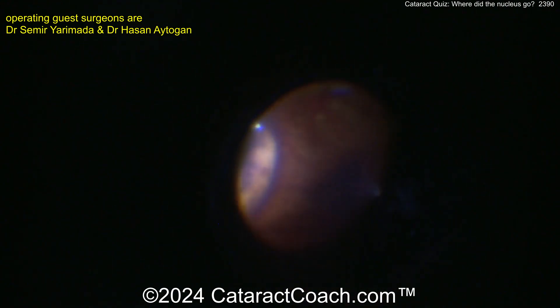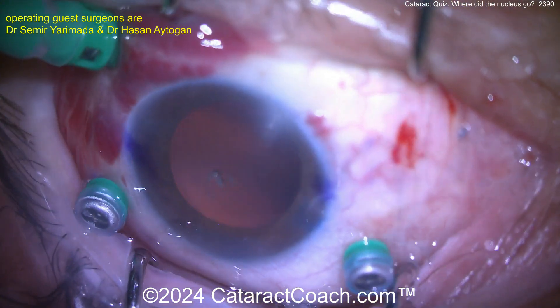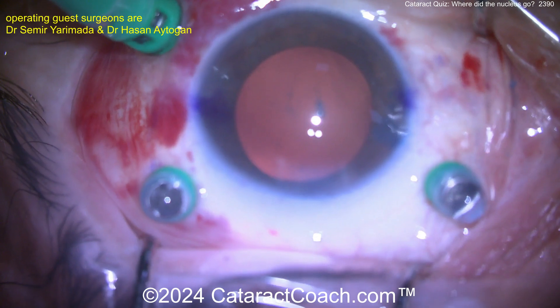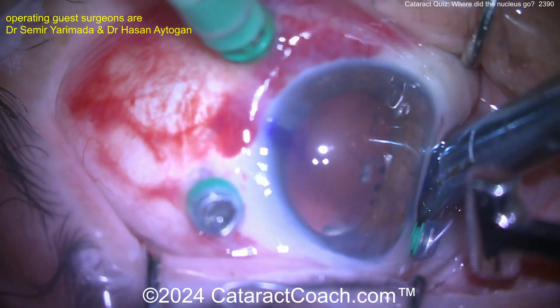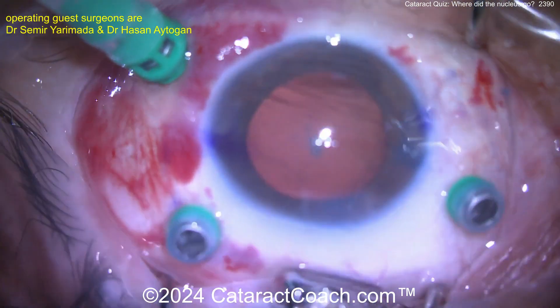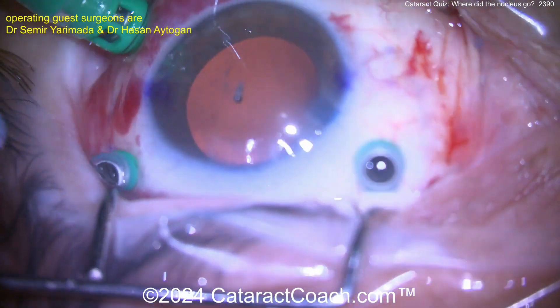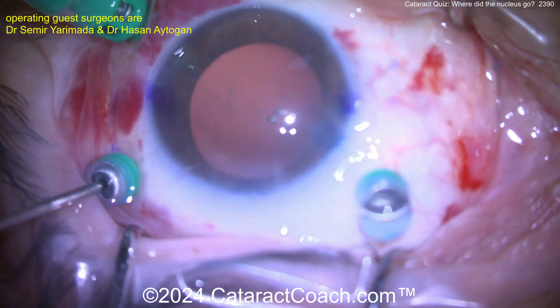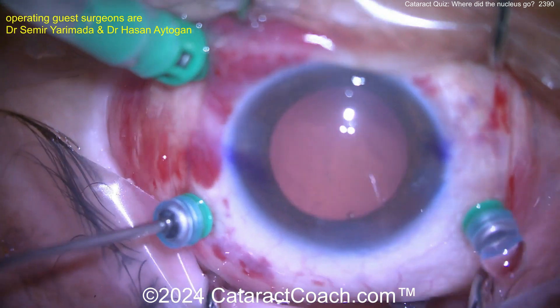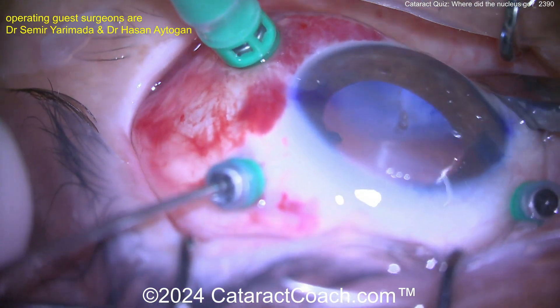Luckily, there is no lens material back in the vitreous cavity. At this point you can put in the IOL. The capsule was completely useless in this case. Let's see what's going to happen — the light pipe checks the retinal periphery one more time.